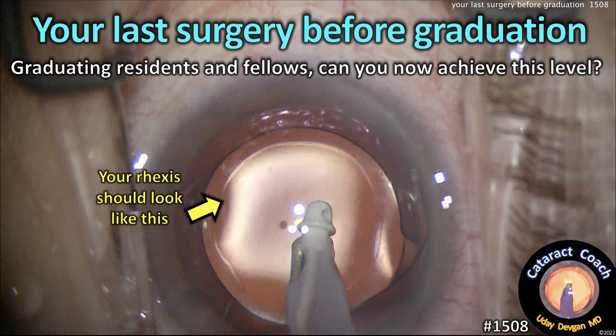CataractCoach.com — your last surgery before graduation. Attention, graduating resident fellows: can you now achieve this level?